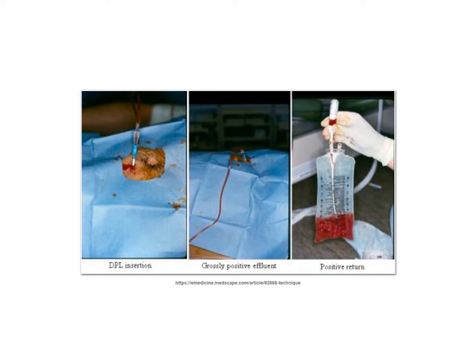And so as a surgeon, your option is to go to the operating room and do an X-lap and see if there's blood, or wait and see if the patient improves without going to the OR. And so what was happening was that surgeons were going to the OR and opening the belly and not finding any injuries. And that was because the hypotension was from something else, the injuries were outside the abdomen, and so on and so forth. And surgeons never want to go to the operating room, cut someone open, and realize they didn't need to. So they came up with a test that was designed to show them if they should go into the abdomen without cutting the person open.